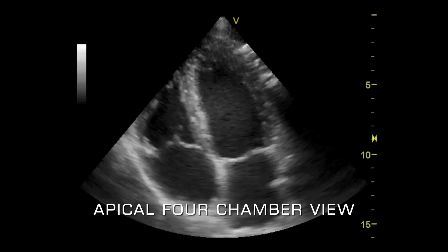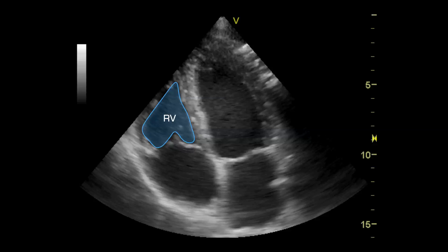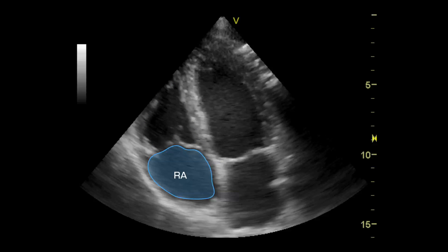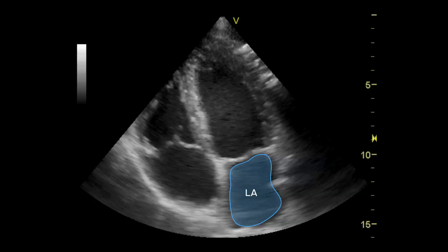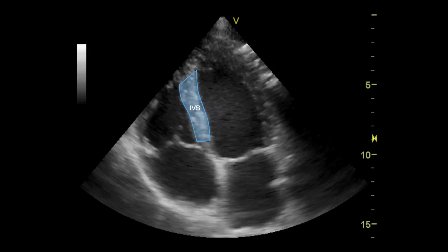In the apical four-chamber view, the right ventricle, right atrium, and tricuspid valve are on the left side of the image by convention. The left ventricle, left atrium, and mitral valve are seen on the right side of the image. The interventricular septum is visible as well as the lateral wall of the left ventricle.